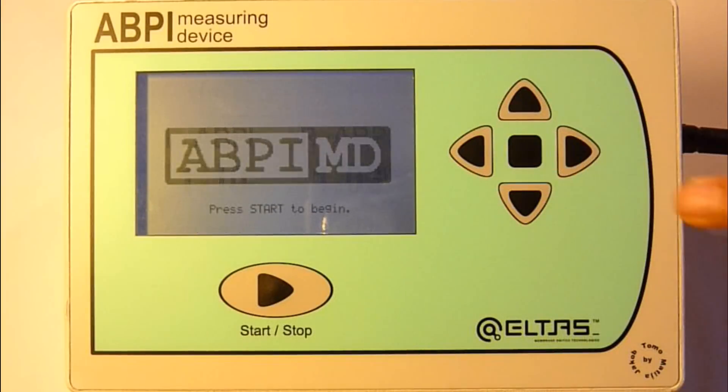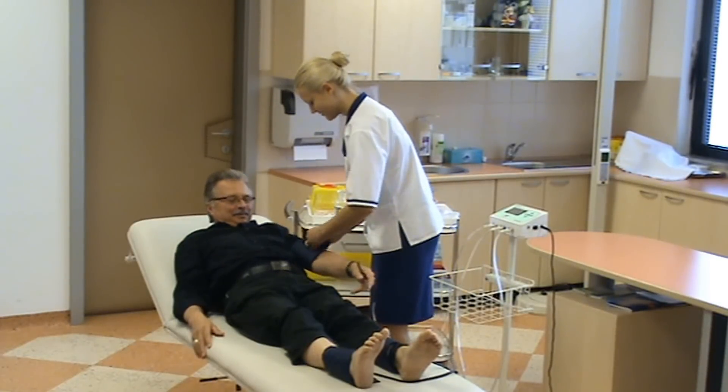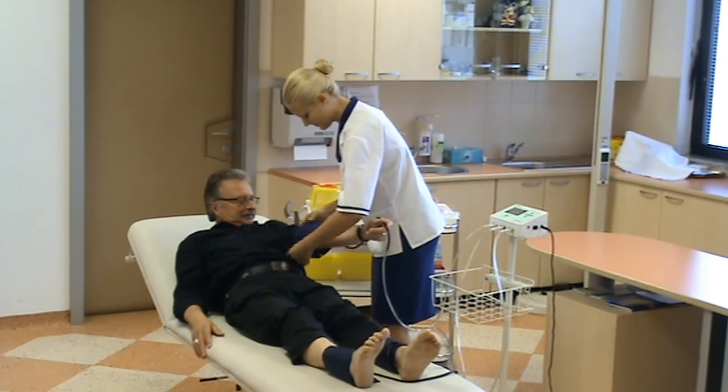In this case, the patient isn't at risk of peripheral vascular disease. The cuffs are removed and the doctor can decide about the patient's further treatment.